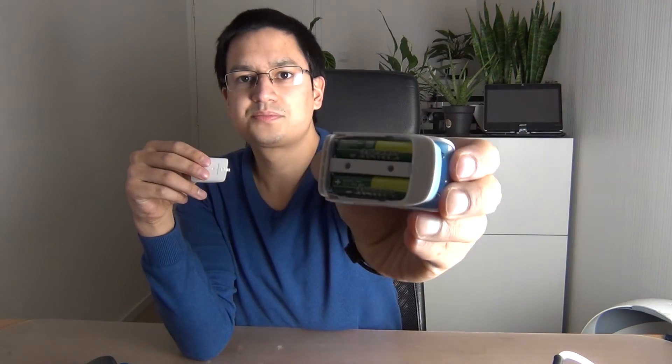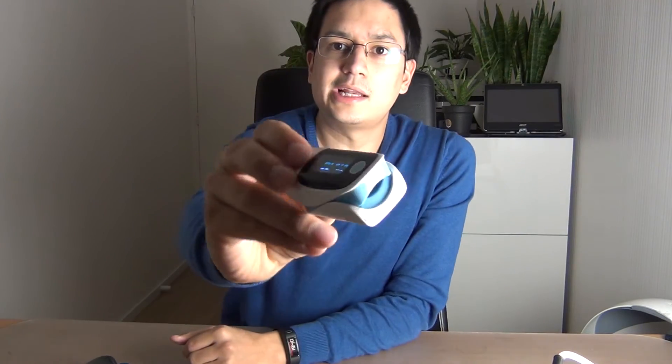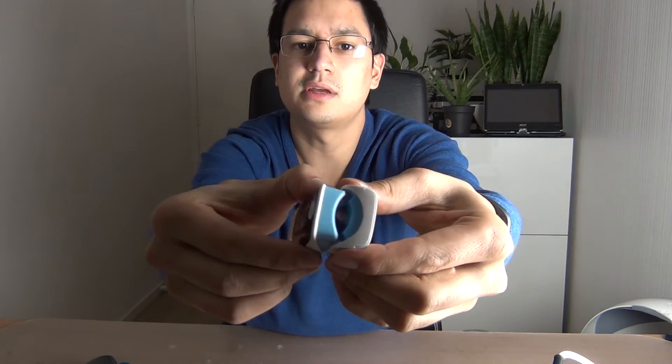I will show you how it works. First of all, it consists of two AAA batteries that can be placed on the back side of the device. It's a tiny clip — you can just clip your finger inside this part, and it can get very large, so even on my thumb it's no problem to mount the device.